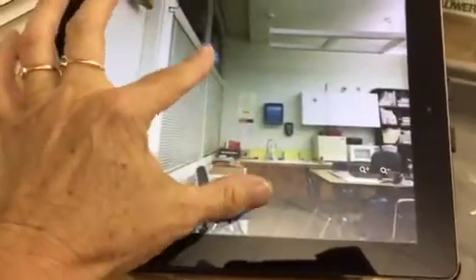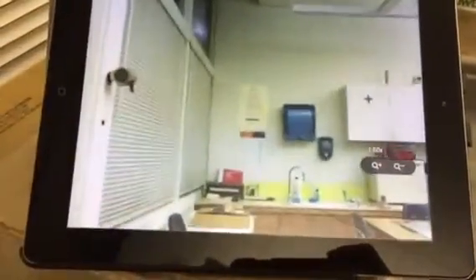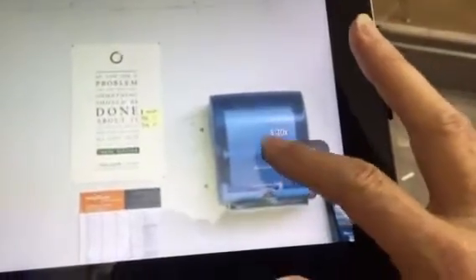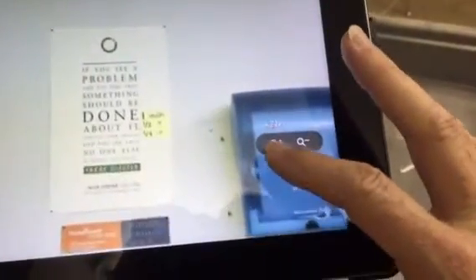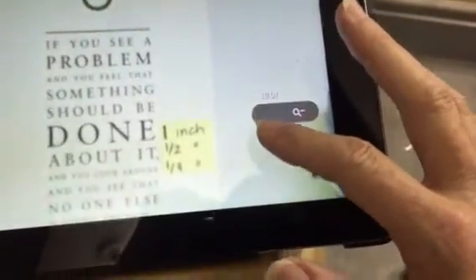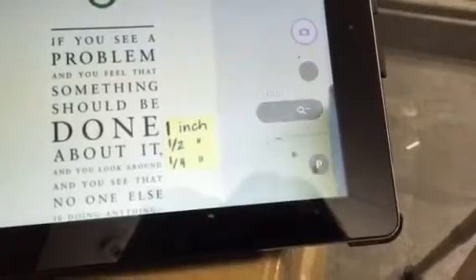On the iPad I can zoom in — I'm doing that by spreading my fingers on the screen — but I also have a button here that has plus magnification. So I'm tapping that, zooming in now to five, six, seven and a half, eight and a half. Right now I'm all the way at ten times magnification.